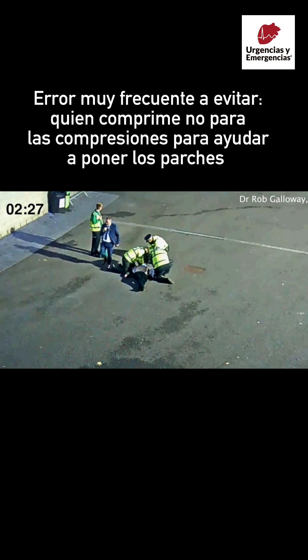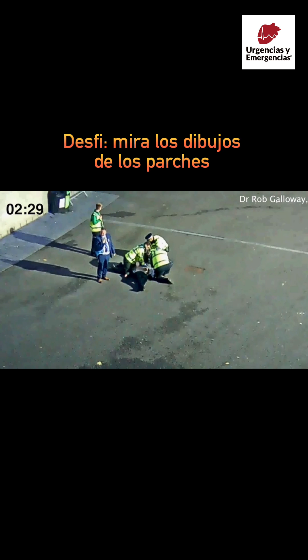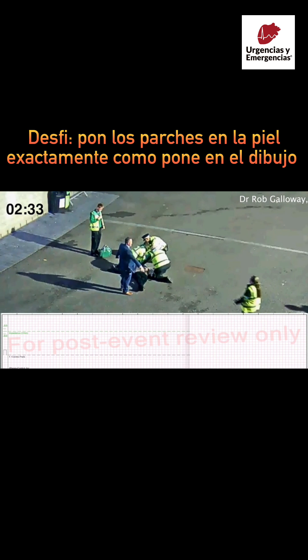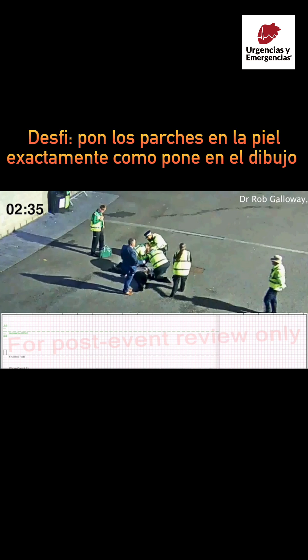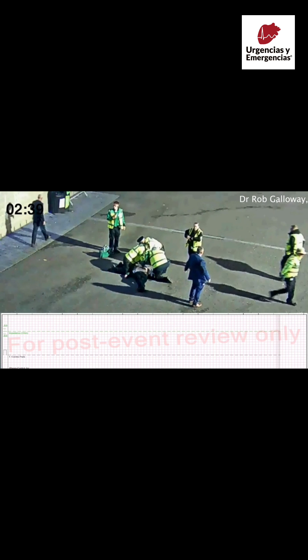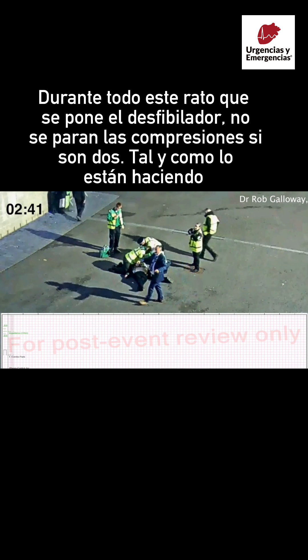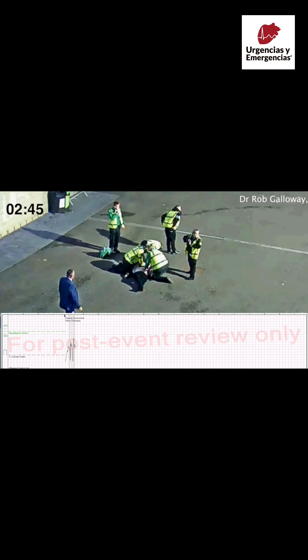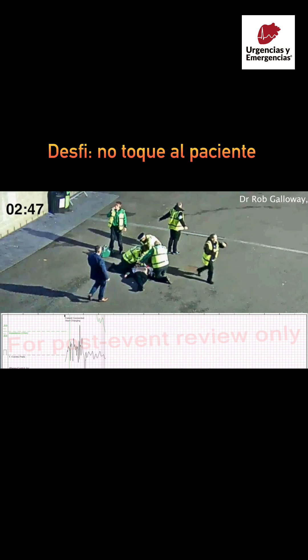Pull red handle to reveal pads. Look at pictures on pads. Apply pads to bare skin exactly as shown in the pictures. Press pads firmly. Apply pads to bare skin. Do not touch patient.